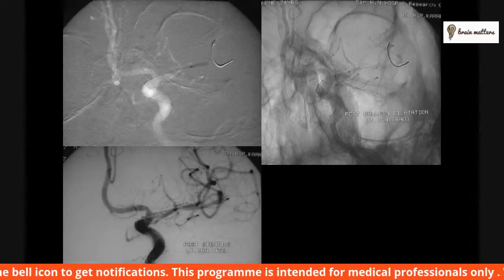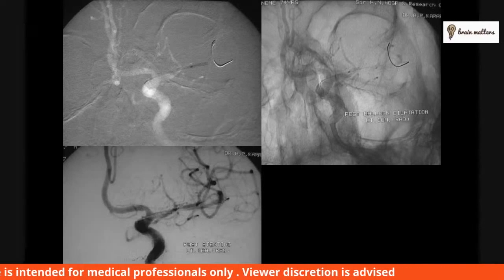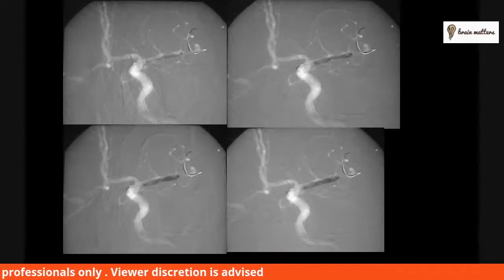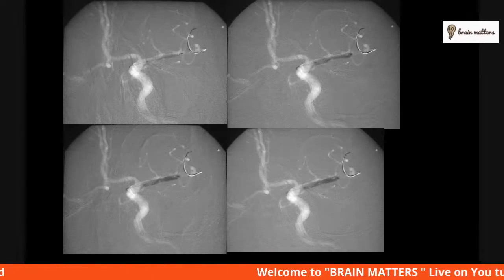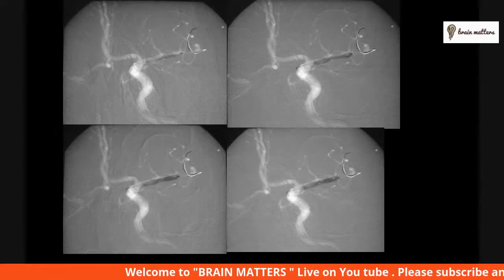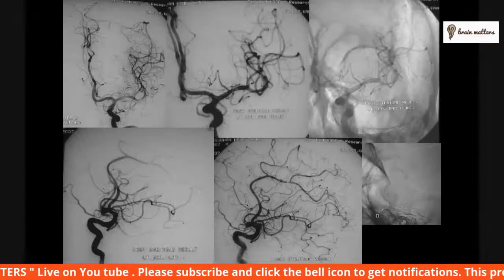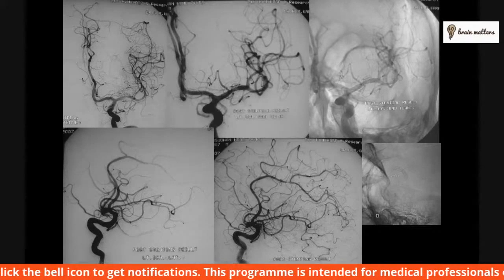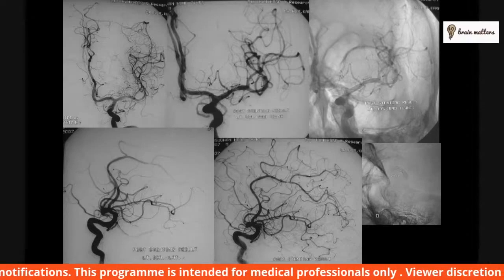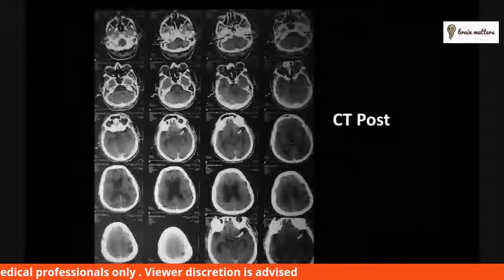So once the Echelon was across, we exchanged with a 300 centimeter Stabilizer cardiac wire. And on that Stabilizer cardiac wire, like I said, I used to like direct angioplasty. So here it is. We've done a direct angioplasty. And look at that artery now. And you can see that we've got a fairly good reconstitution of the M1.